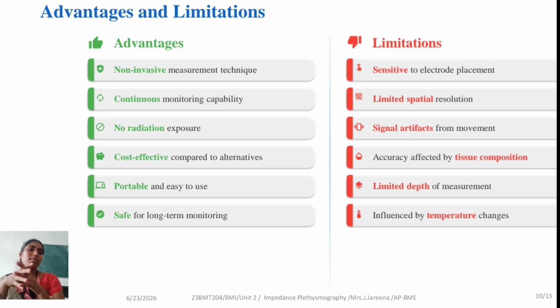So finally we have advantages and limitations. The advantages: this is a non-invasive and continuous monitoring method with no radiation exposure, and it is easily affordable to everyone to measure the blood volume. It is also portable and safe for long-term monitoring.